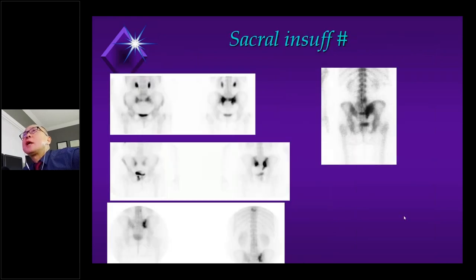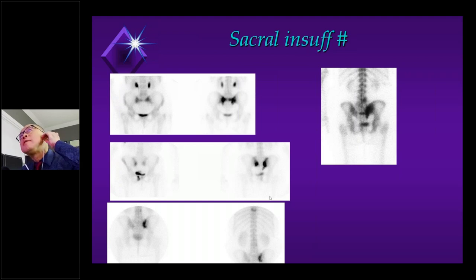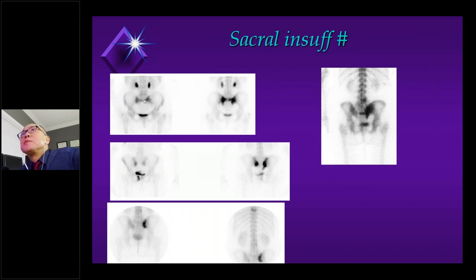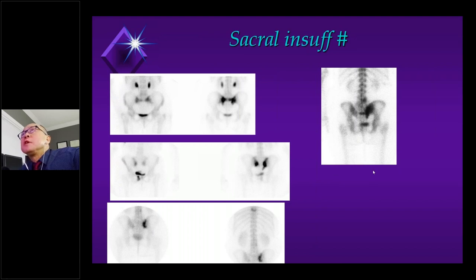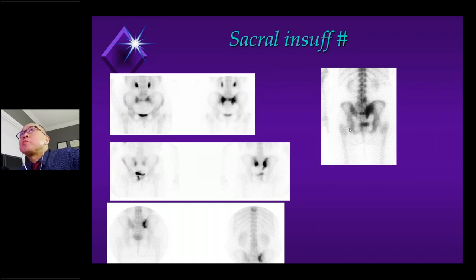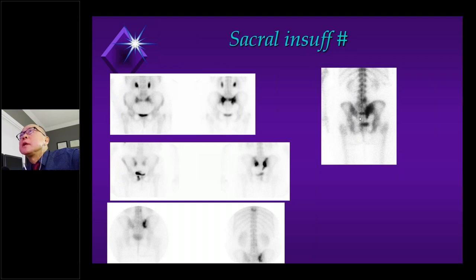The sacral insufficiency fracture is a classic planar pattern. The classic Honda sign can have variants — a missing horizontal bar, vertical bar, or both. With the classic history of sudden onset atraumatic pain, it's important to recognize that as a Honda sign, a benign sacral fracture. In one case, I literally had the bone biopsy needle in my hand about to perform the procedure when I pulled out a bone scan from the film jacket — seeing this, I canceled the bone biopsy. That is a benign sacral insufficiency fracture.